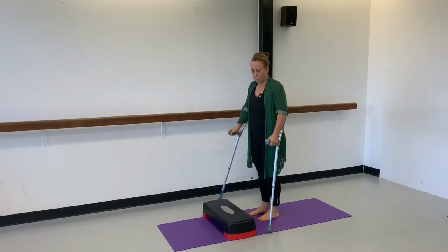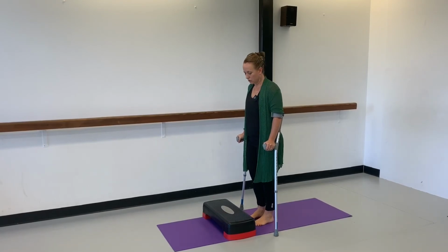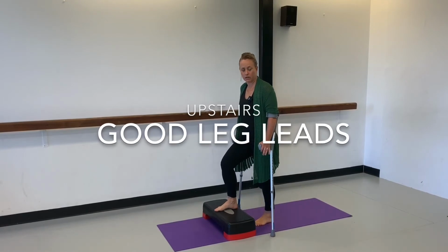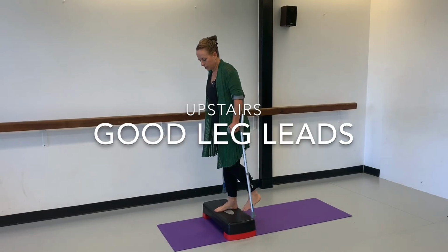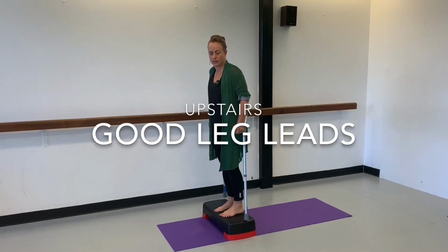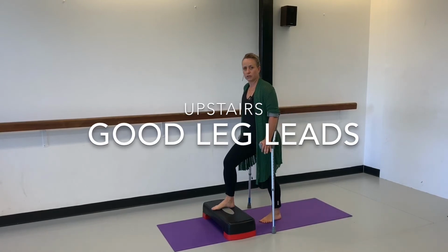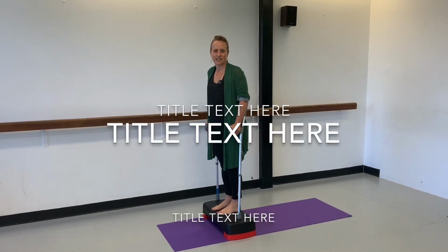But to get upstairs, we say good leg goes to heaven. So you'll take your good leg up the step, and your crutch stays with your affected side. So your good leg goes up the steps and your crutches and your sore leg will come next. So to get up the steps, good leg goes to heaven, it will go first and your crutches follow you. If you're on 1 crutch, it's exactly the same.